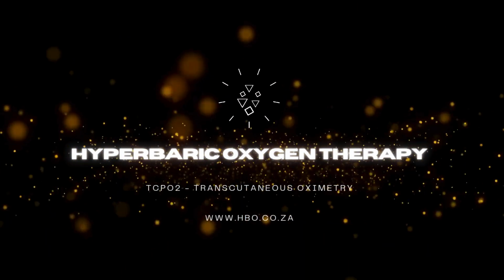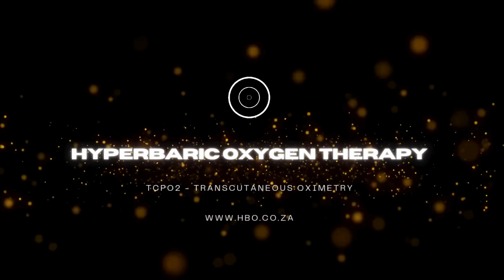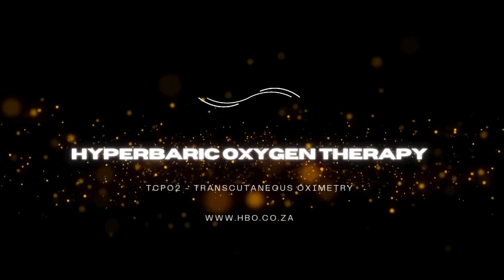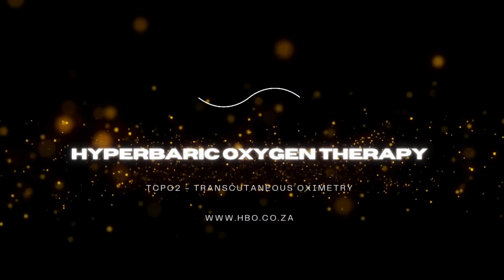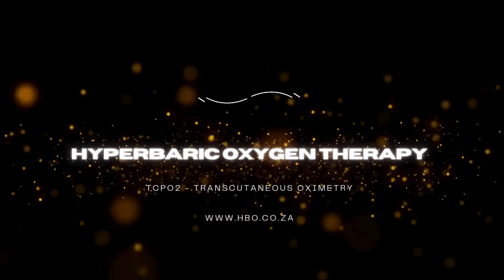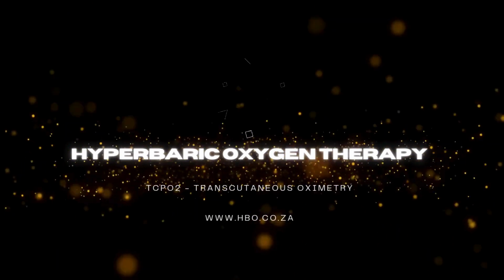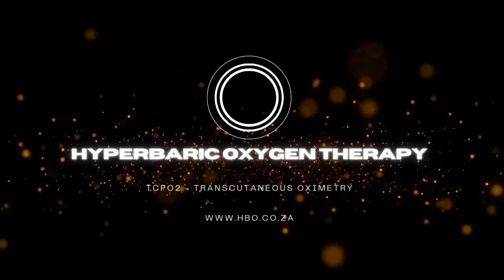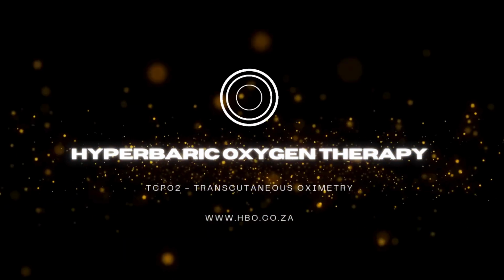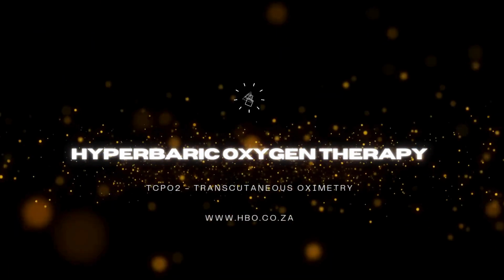Okay, so where does this become really valuable for making those tough clinical calls about using HBOT? Patient selection is a big one. Take problem wounds, chronic wounds. A lot of them are fundamentally hypoxic, right? Right, lack of oxygen is often the core issue. So TcPO2 gives you a reliable way to measure that baseline tissue perfusion under normal air conditions. But more importantly, it lets you see the potential for improvement during a test dive or the actual therapy. That makes total sense. You'd want some kind of objective sign that HBOT actually has a fighting chance for this particular patient, this particular wound.